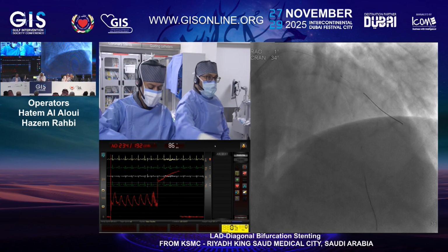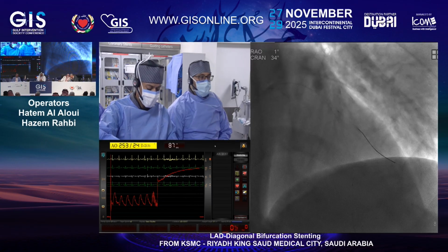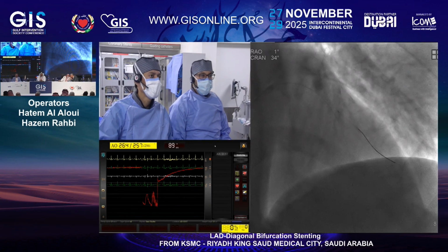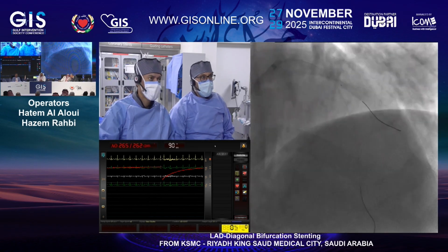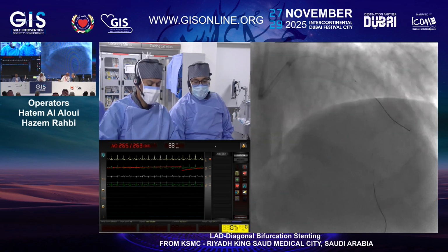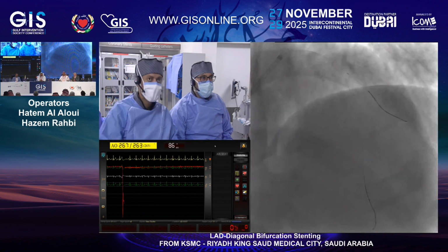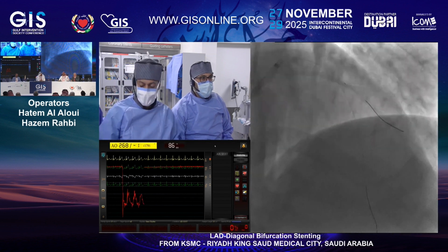How many seconds? I think it was only 40 seconds because he started having ST elevation, so we stopped the inflation. I think it's enough, as you have said. 10 seconds, 15 seconds are enough with this technology.